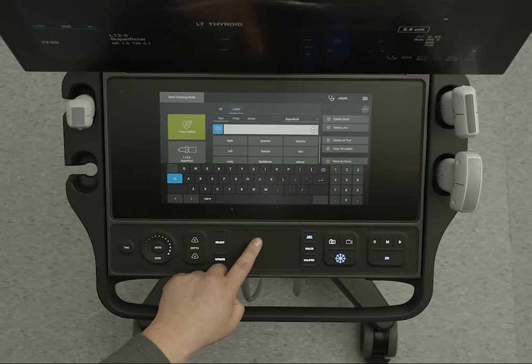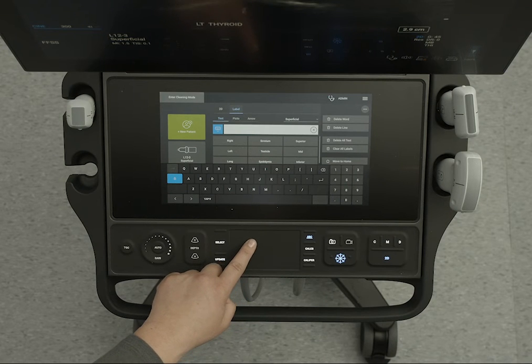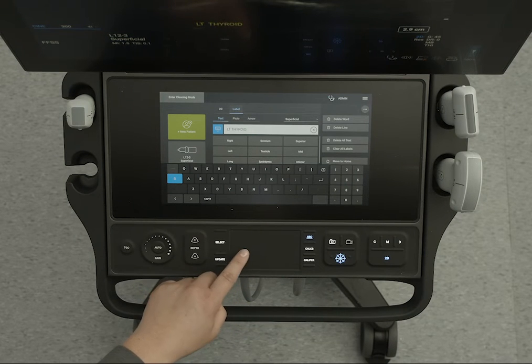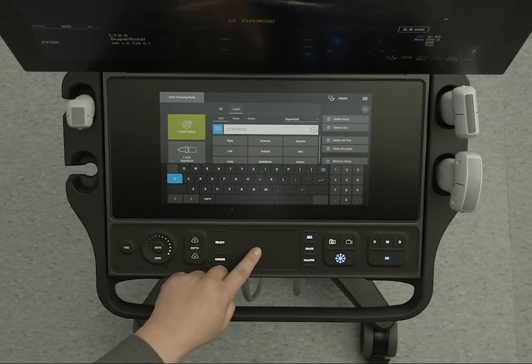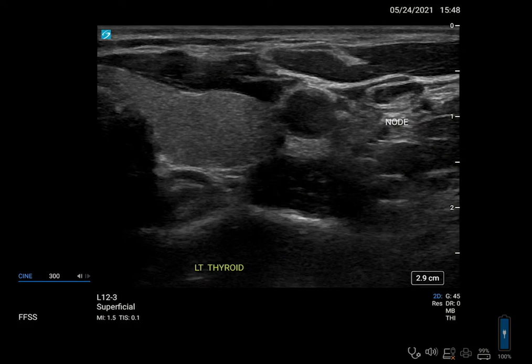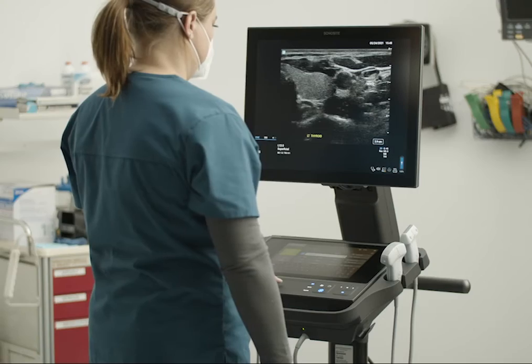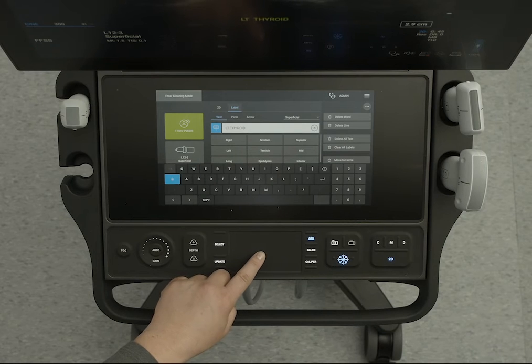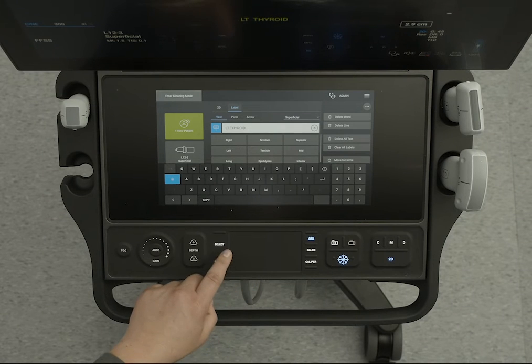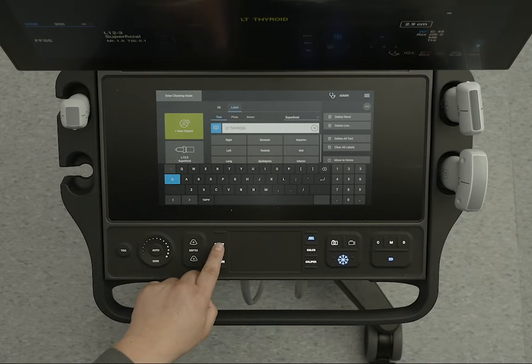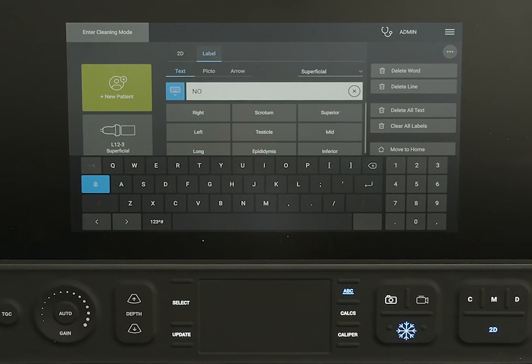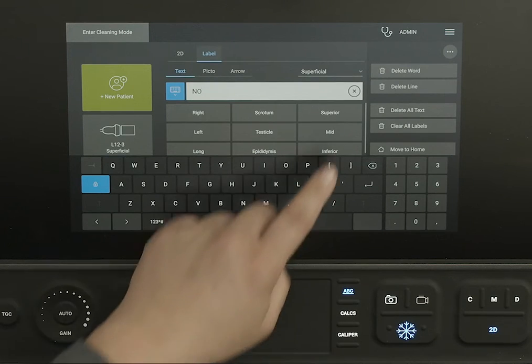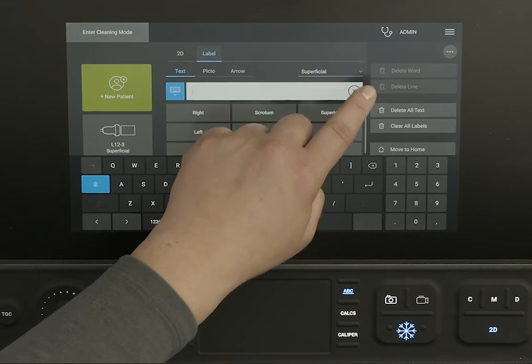First, select your label by moving the cursor over it and pressing the Select button. The selected label should now be highlighted. Now, let's move your label. While the label is highlighted, you can move it using the touchpad. You can also edit it in the text box, or you can delete it.